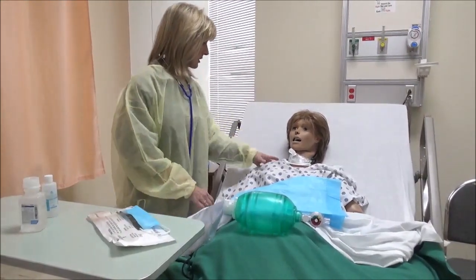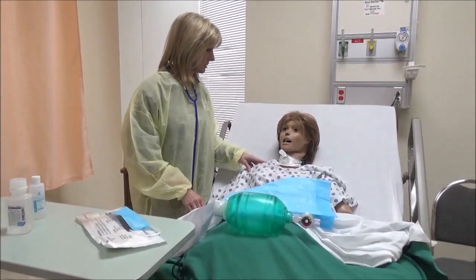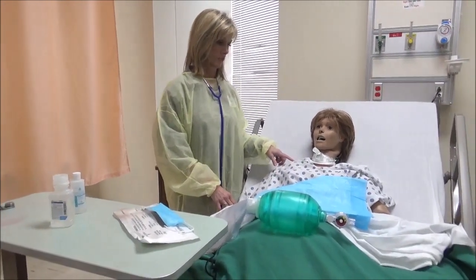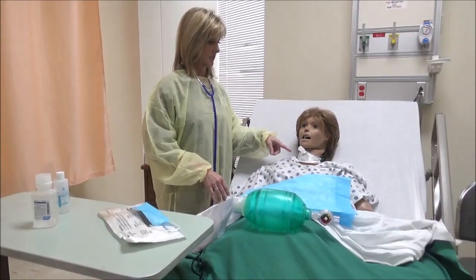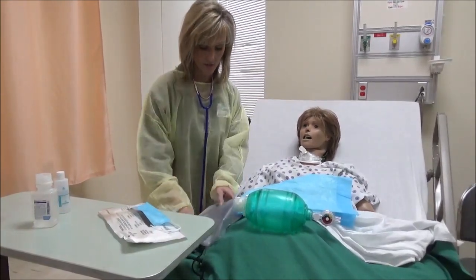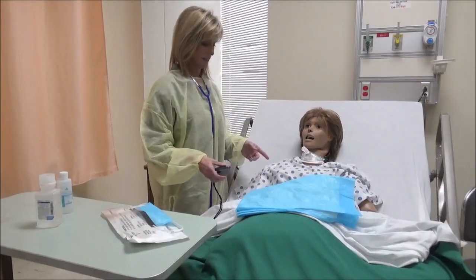So, Ms. Jones, I'm Annette. I'm your nurse for today, and I'm going to assess your lungs and see if you need trach suctioning. Now, to do that, I'm going to need to do a couple of things. I'm going to need to make sure I listen to my client's lungs. I would notice if there were any visible secretions coming out of the trach itself, or if my client's O2 saturation level was dropping, that would be some indicators of my client needing suctioning.